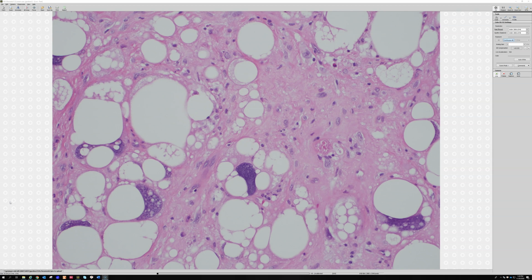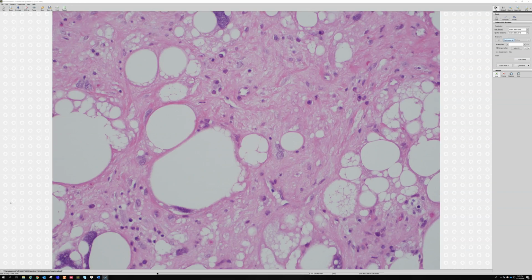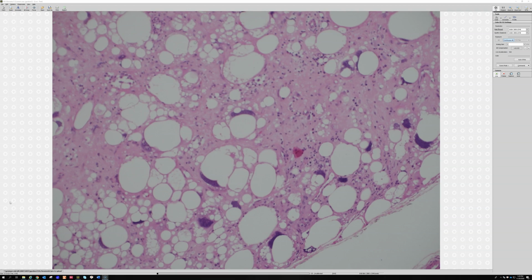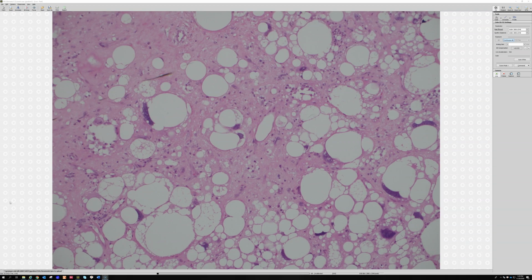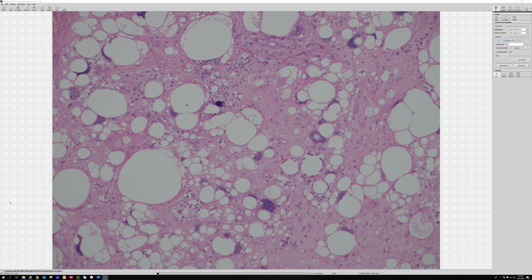All right, so for well-diff liposarcoma, what is the molecular abnormality that we would expect to see? MDM2. Yeah, MDM2 amplification, and you can also see other genes like CDK4 and some others that are amplified as well. So you can test that with immunostains, or my preference is to use FISH, but I know people that like using immunostains too because they're a little quicker and easier to get a hold of in some other labs. So, all right, well-differentiated liposarcoma with really bizarre scattered pleomorphic lipoblasts.